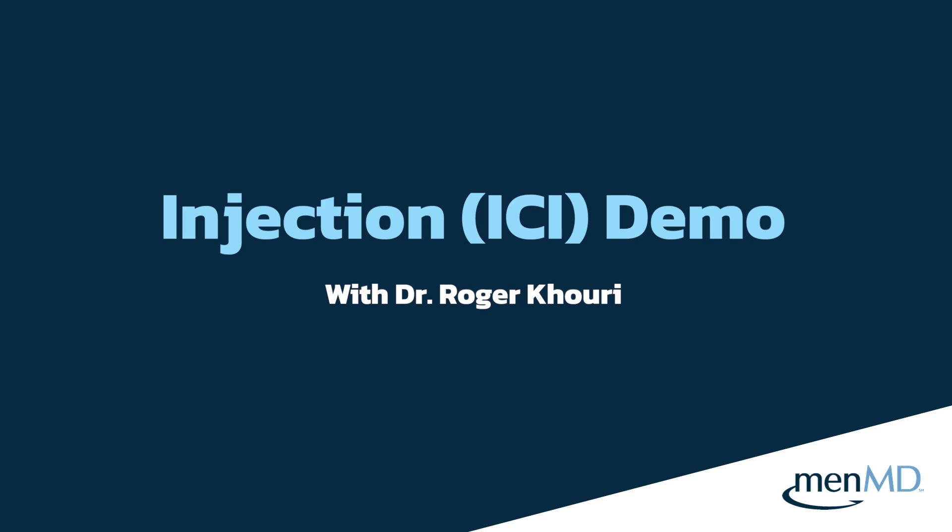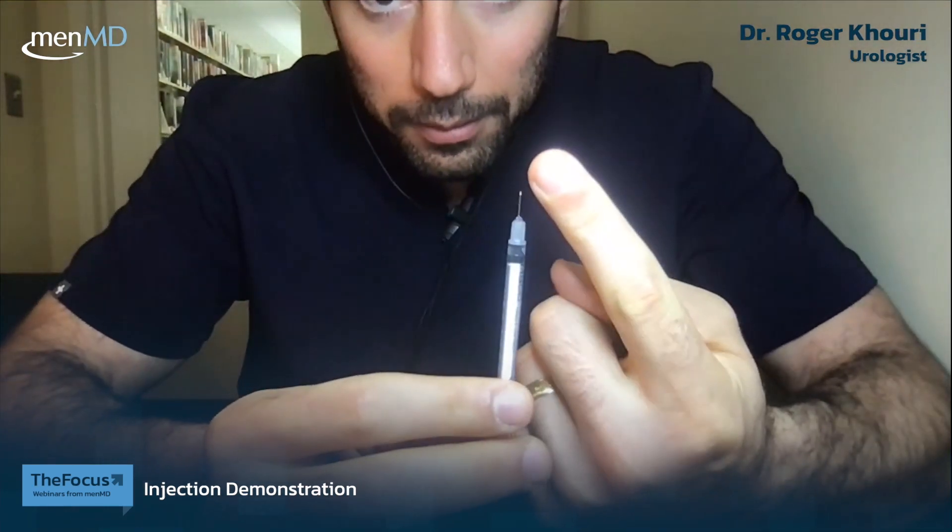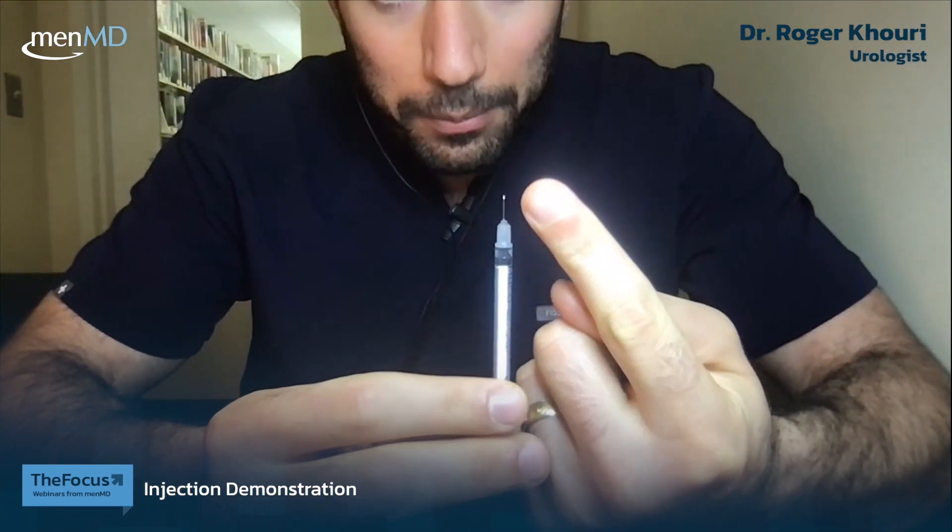I'm going to turn my camera down a little bit so you can see the demonstration. It should be really straightforward and simple. You basically just need three things: your drug, your syringe with the needle, and your penis. First, take off the orange cap protecting the plunger and the one protecting the needle. Notice how small this needle is relative to my finger — I've got pretty big fingers — so this is a tiny needle that really should not hurt.